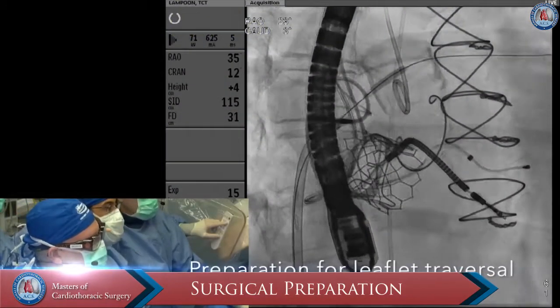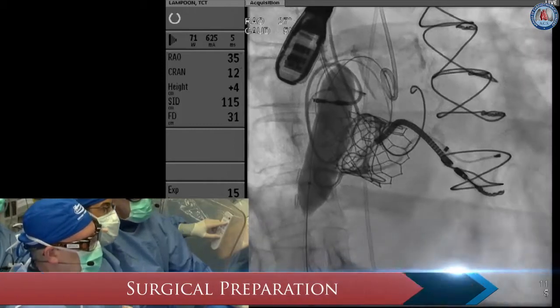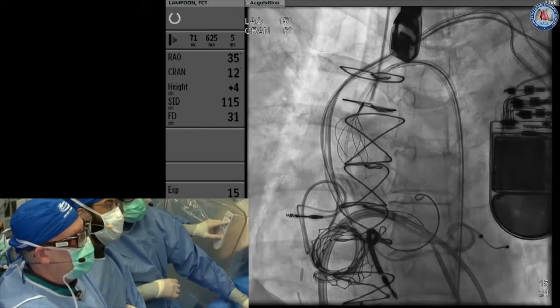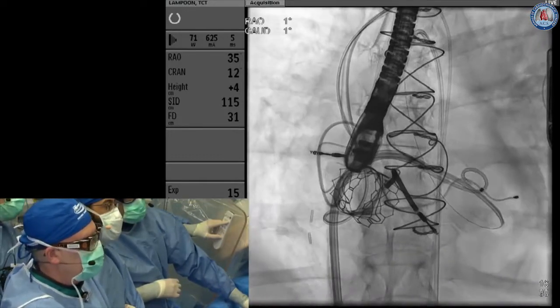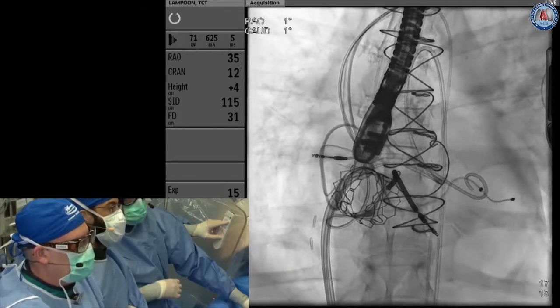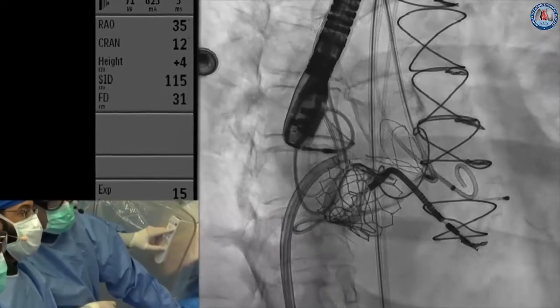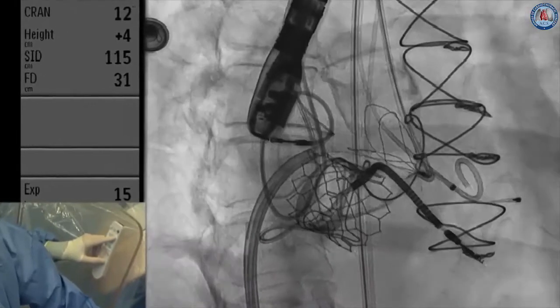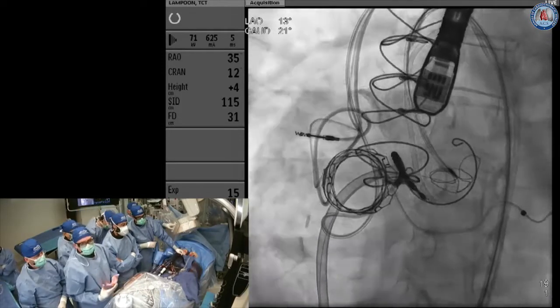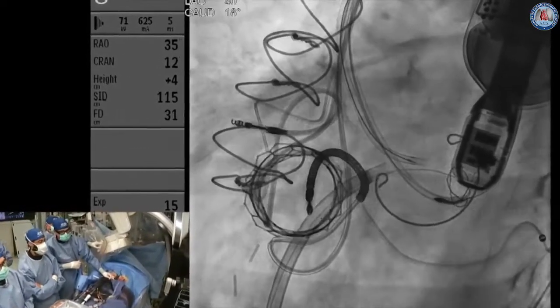The procedure starts with a transseptal. We had a thick septum — there may have been a patch there — so we ballooned across it just to get our catheters across. Once able to get the sheath across, we did our full septostomy for valve delivery. The big sheath is already in the vein, we've pre-closed the vein. We use an Agilis and float a wire through, and similar to the antegrade approach, we get out through the aortic root and snare it, creating an AV loop. That's a 300 run-through wire acting as a rail. Then over that run-through wire, retrograde from the femoral artery, we place a catheter across the aortic valve up into the left atrium and open a snare to receive the wire — that's an 18 by 30 snare. A second catheter comes from the right groin into the LV, targeting the base of the anterior leaflet.